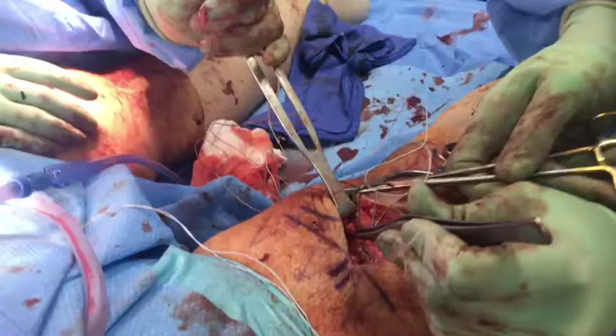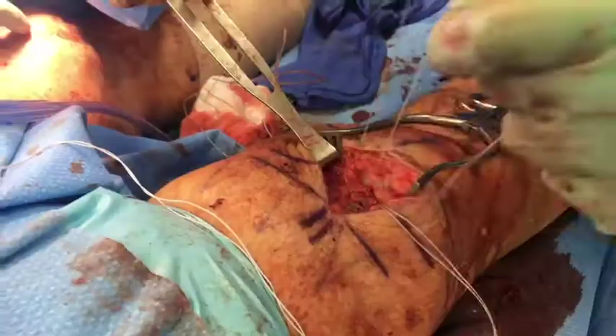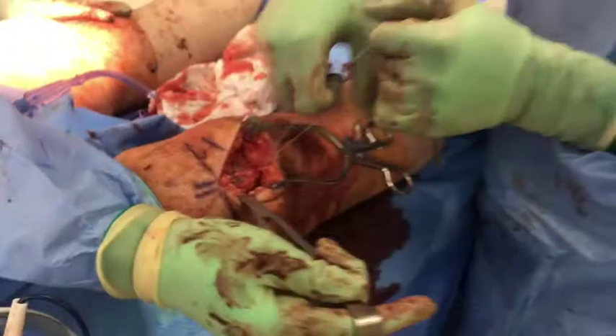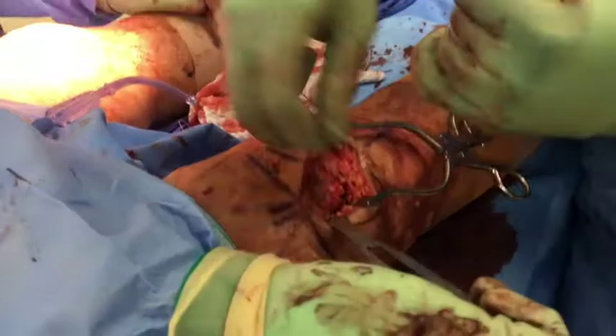One limb is passed through a free needle and several running locking throws are passed through the medial retinaculum before reinforcing the repair. This is then tied down and the same is repeated for the lateral retinaculum. If there is any remaining retinacular tear, this is closed using several figure-of-8 Vicryl sutures. The final repair construct is demonstrated here.